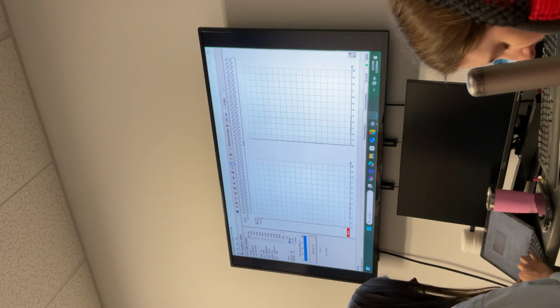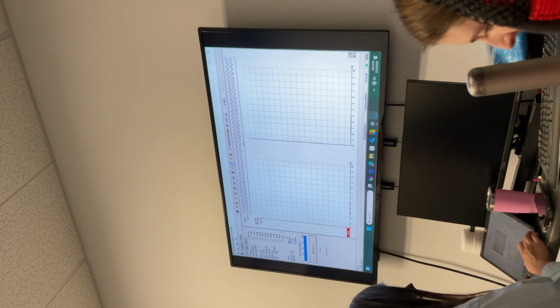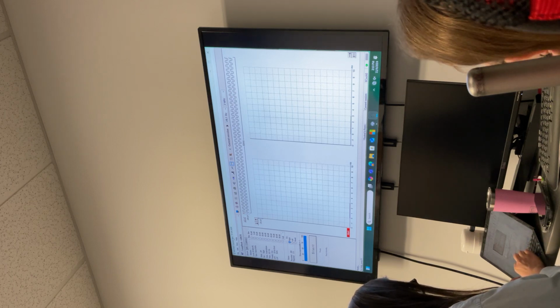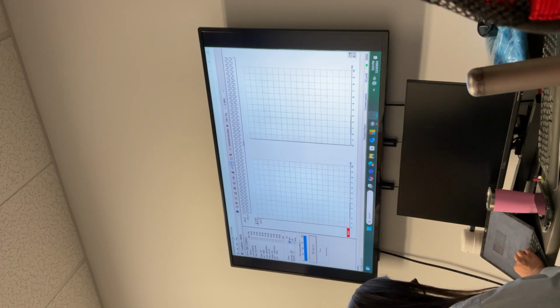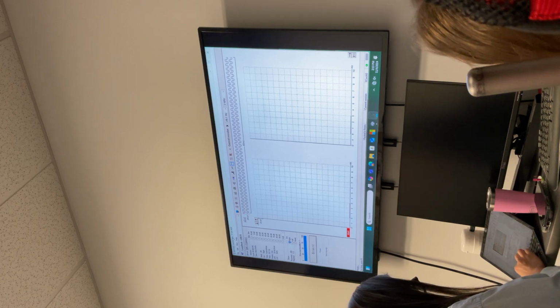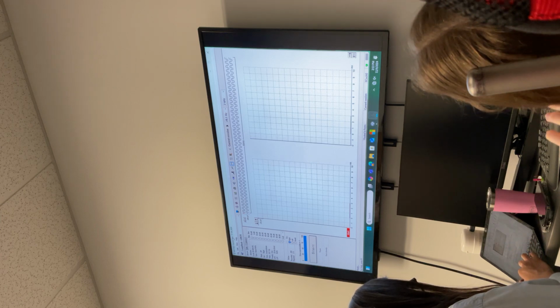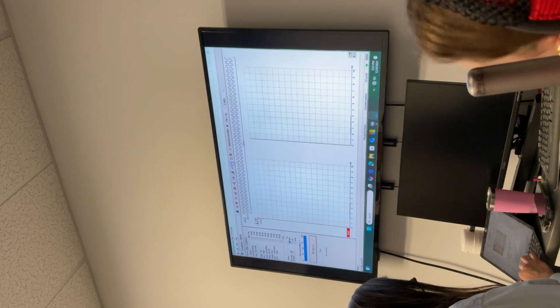If you're not confident at 30, then go up to 50 or 40. And you need to use that, increasing the number of averages, repeating the recording. Because in a clinical setup, you don't have time. Once you see the response is around 30, 20, then you start around there.